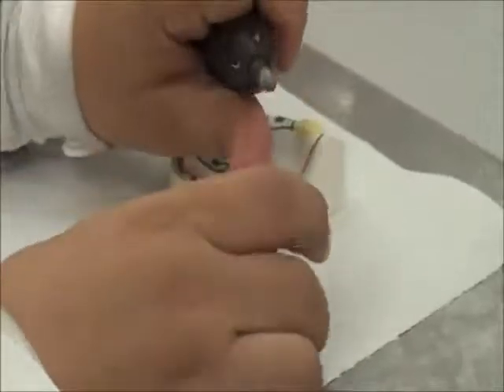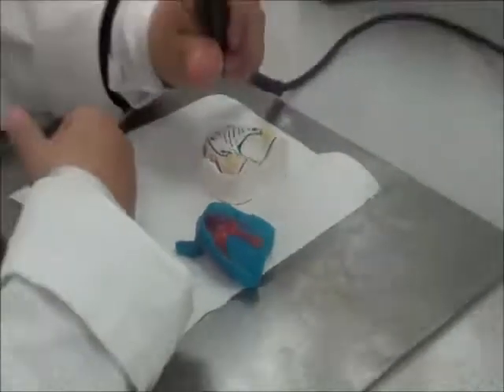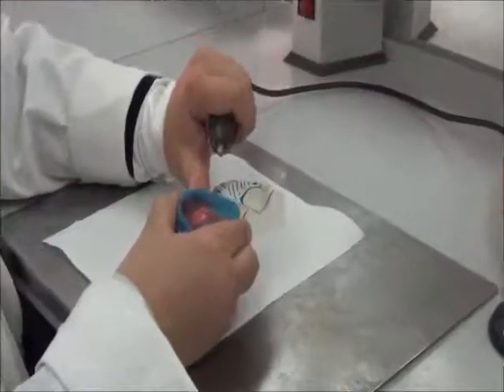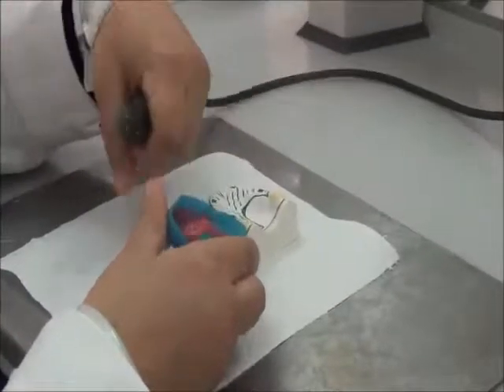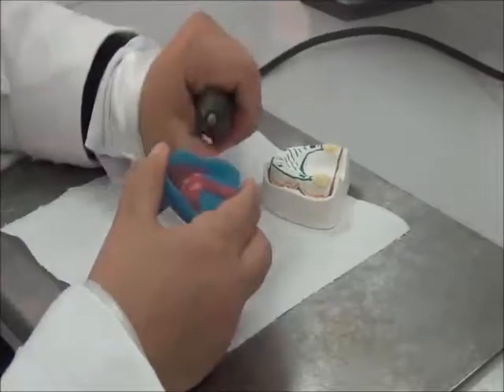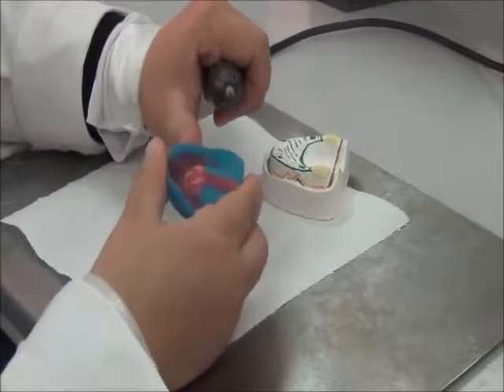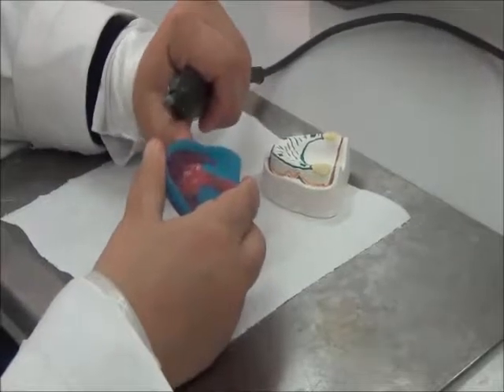I also want you to notice that I'm holding with what we call the safety grip. I hold the handpiece with four fingers, and I leave my thumb out to rest on the material that I'm trimming. If I don't have this hand rest, it might slip away and traumatize me in some way, because it's not safe. Sometimes you're pressing so much and it simply slips away. So we need to make sure this slippage, if it occurs, is controlled. We put a finger rest here and we work. Even if this slips away, my finger is preventing further movement.